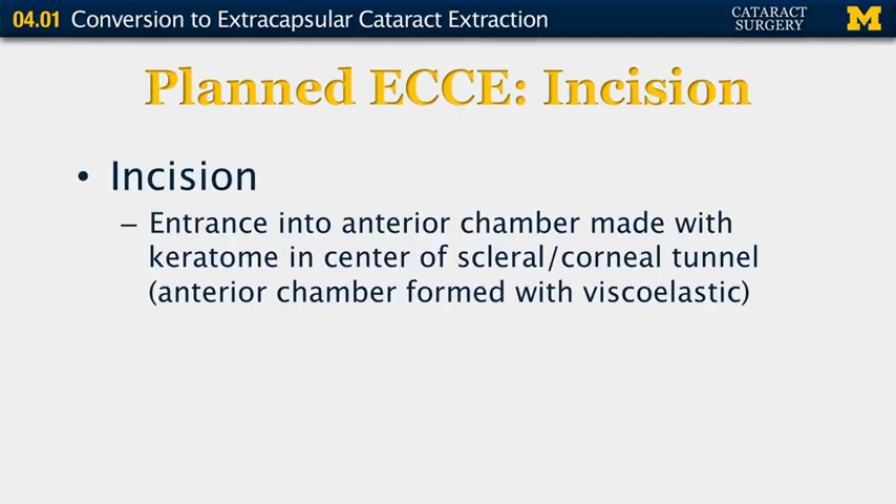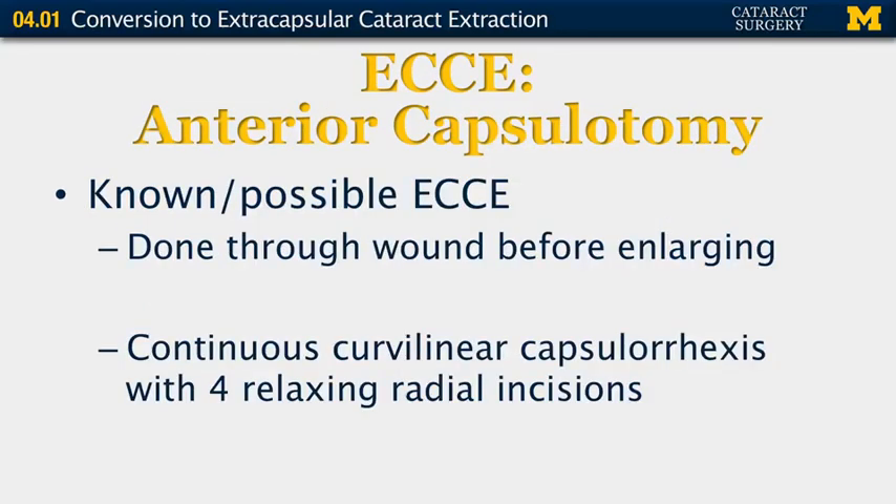After the tunnel is created, you want to enter the anterior chamber with a keratome in the center of the scleral or corneal tunnel, and the anterior chamber should still be filled with viscoelastic. For the anterior capsulotomy, if you know you may possibly be doing an extracapsular cataract extraction, this should be done through the wound before enlarging it so that the anterior chamber stays formed more readily.